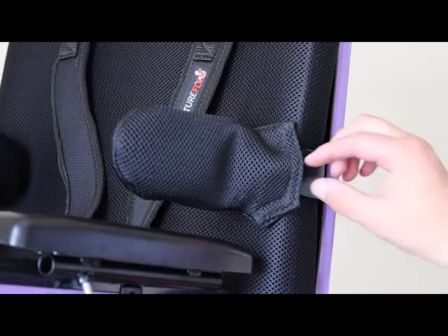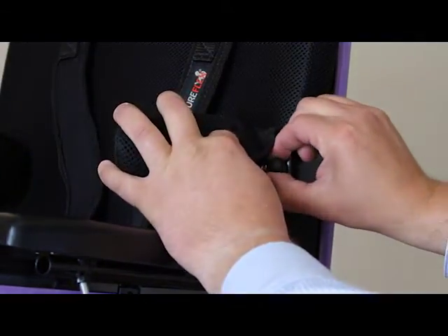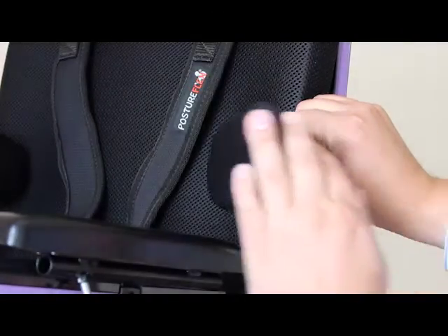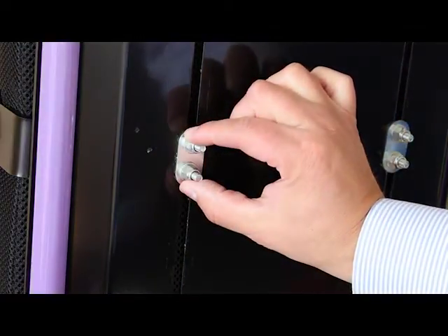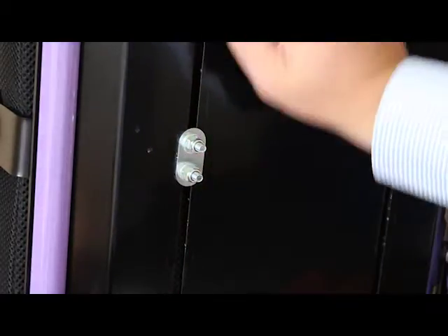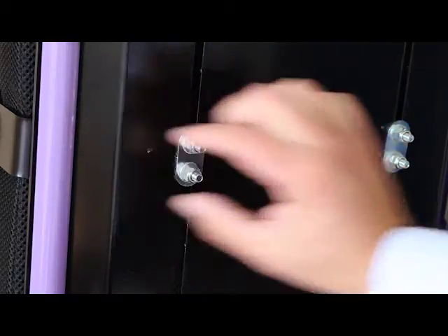The swing-away lateral supports are operated by pulling back the cover to reveal a button, which you pull to swing the lateral support away. The lateral supports are adjusted for height and width by undoing the bolts on the back of the chair. You can slide up and down the full length of the slot, and the backs of the laterals are also slotted so they can be moved the other way as well.